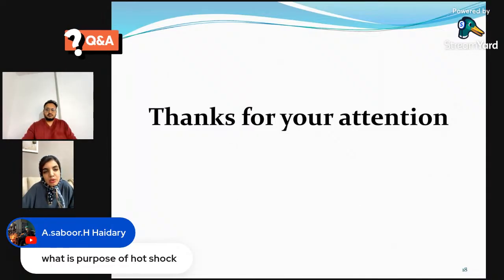I think the question was mini cardioplegia. My answer is that cardioplegia is called microplegia. So mini or micro, I don't know if my answer is true, but I said it involves injecting a small controlled amount of special solution to temporarily stop the heart.